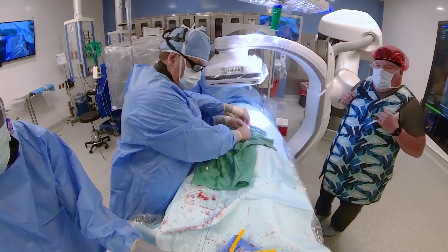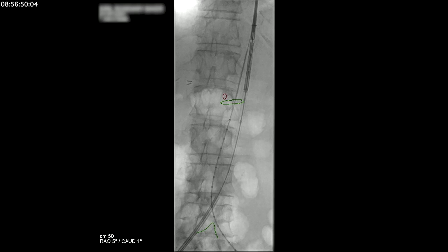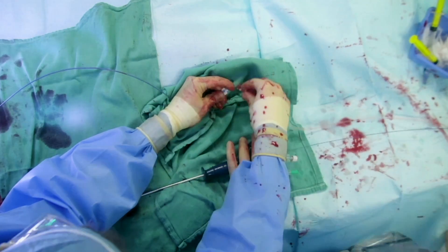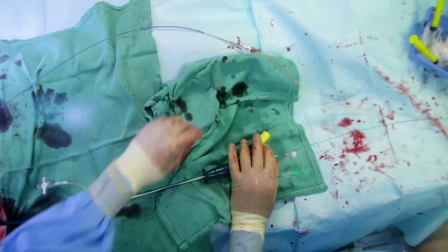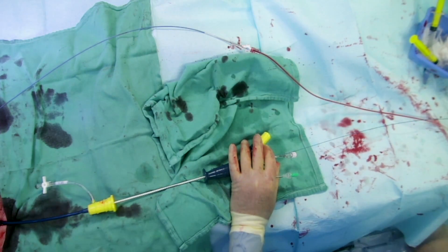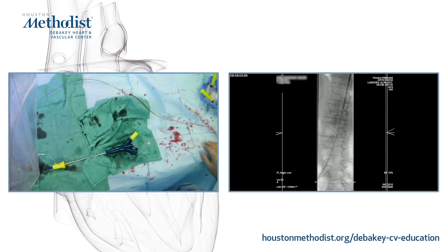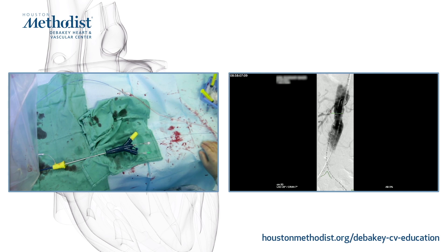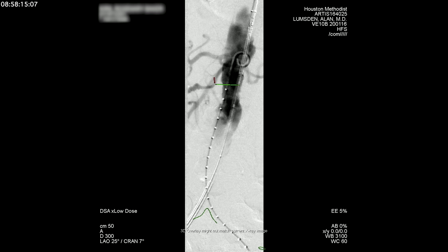After positioning the main body into roughly the appropriate position based on preoperative CT marks, angiography is then performed to further delineate the anatomy. Aside from the suprarenal stent, the main body has no other stent structure within the main body, allowing the delivery system to be extremely flexible in tortuous anatomy and delivery.